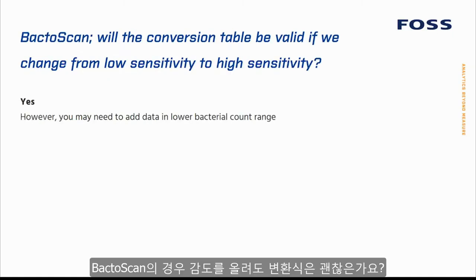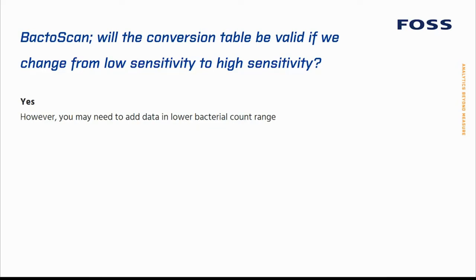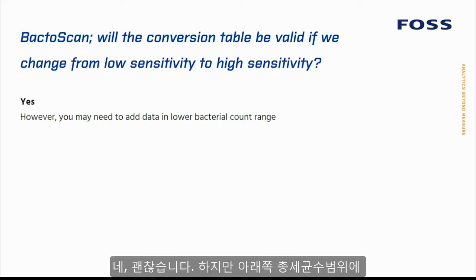BactoScan. Will the conversion table be valid if we change from low sensitivity to high sensitivity? Yes. However, you may need to add data in the lower bacterial count range.